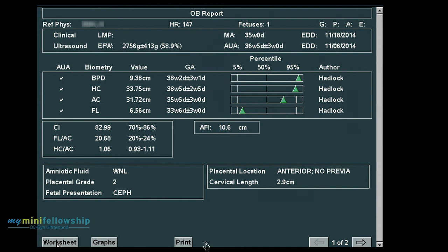And I can tell you that over the last almost 35 years or so, many cases have been referred for exactly these numeric sequences, and those cases have all turned out to be normal. That is why Philly's first rule is never diagnose a skeletal dysplasia when the bones look normal. I've never seen a skeletal dysplasia where I could honestly say, boy, those bones look perfectly normal to me. Great. Thanks.